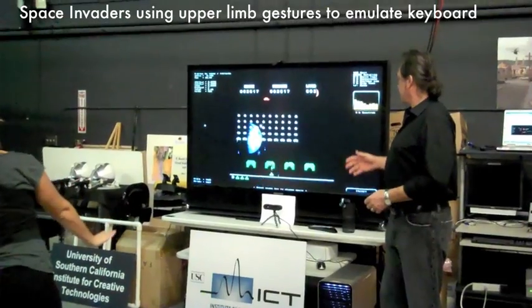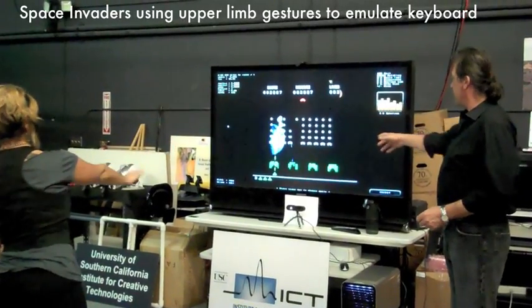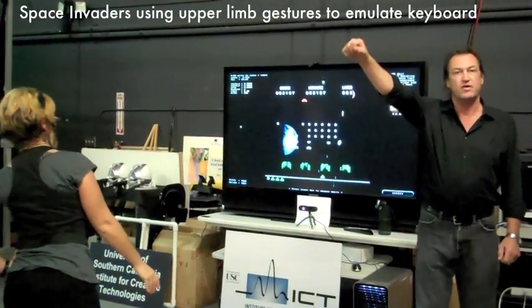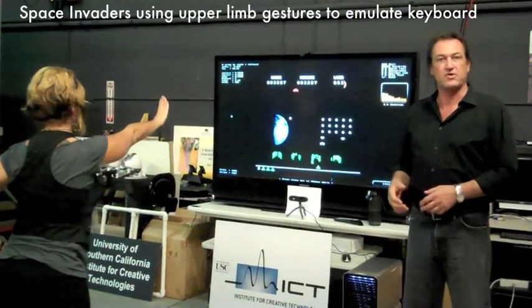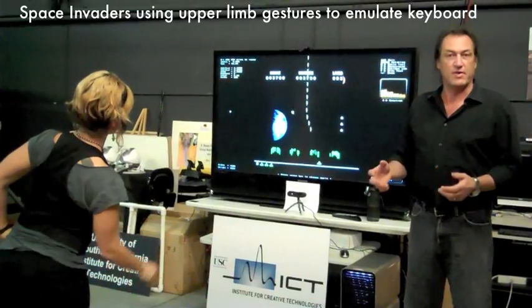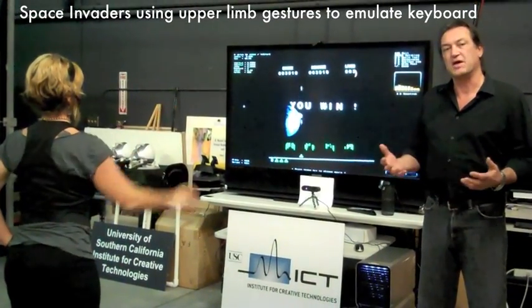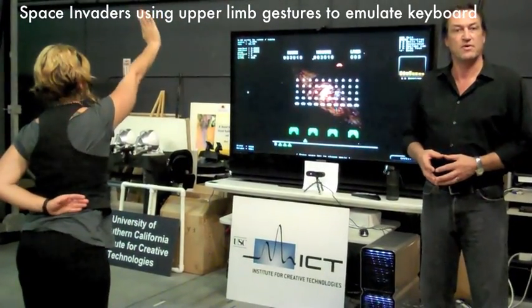In this application, we actually take the input from the PrimeSense camera of the user's movement and use it to actuate a very basic game of Space Invaders. As the user moves from right to left, they can control the missile launcher at the bottom, and when they want to fire, they move their hands forward and it fires. So now we can take basic computer games that rely on a mouse and a keyboard and emulate those activities with actual body movement. This will open up a range of activities for actual physical therapy with games that people are already well familiar with, and it really is the future of virtual rehabilitation.